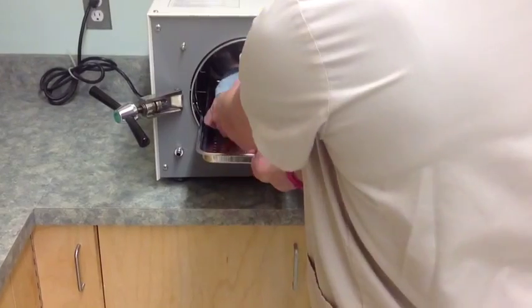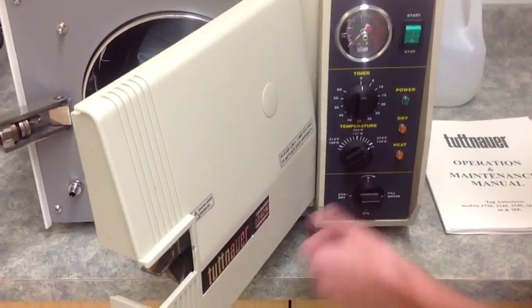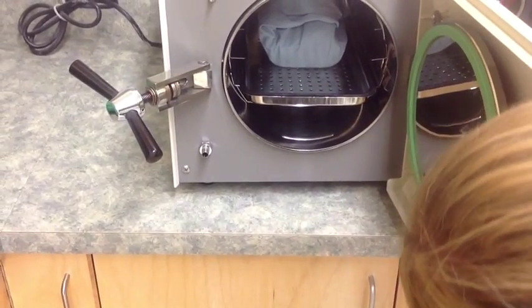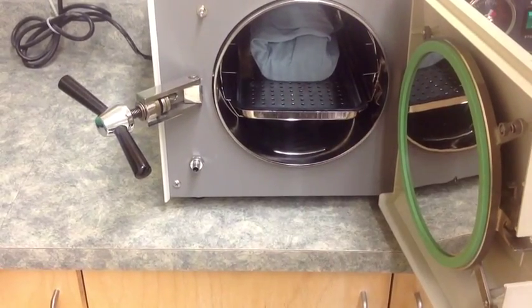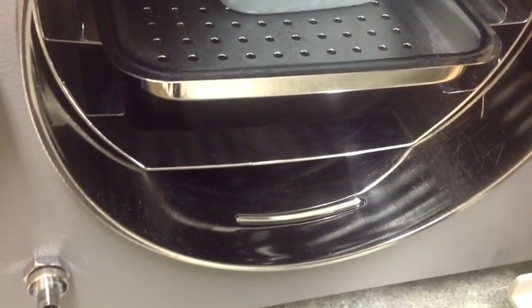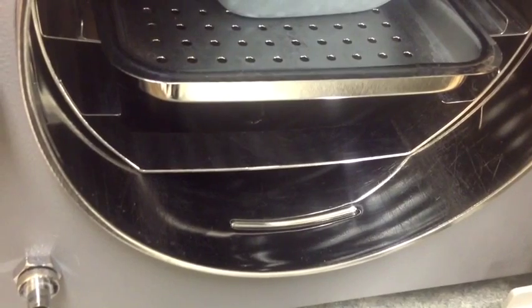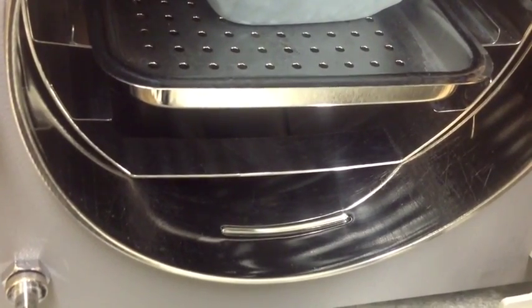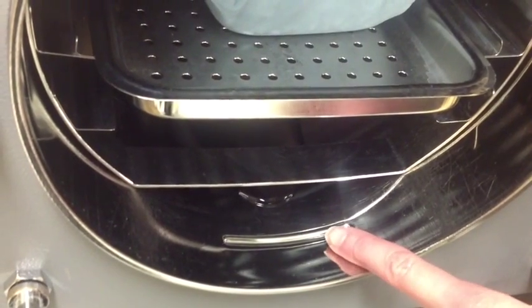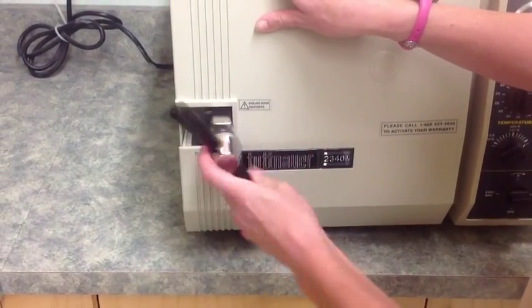Now you're ready to place your pack. Set the multipurpose valve to the fill position to fill the chamber with water. This will take a few minutes. When the water reaches the fill line on the bottom of the chamber near the front, as you can see here, you can close the door and secure it to ensure proper tightness.